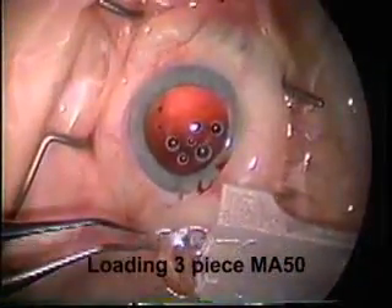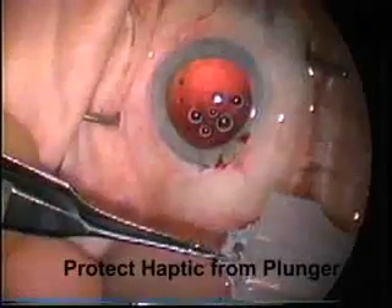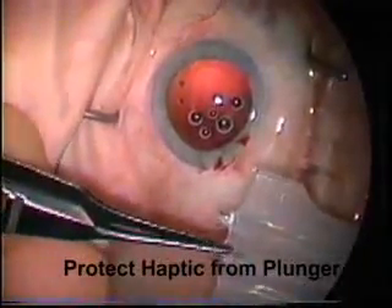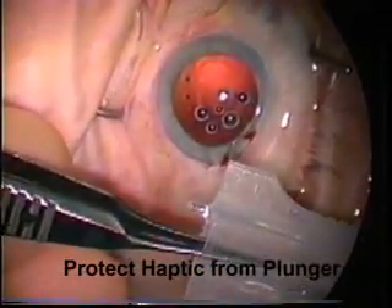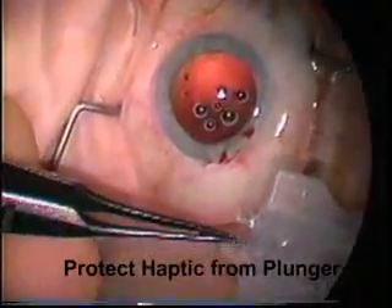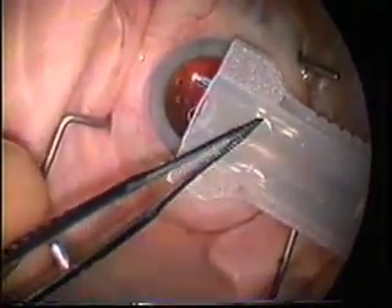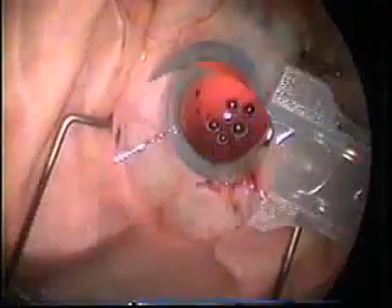The three-piece acrylic lens is loaded in a similar fashion. However, you have to be very careful with three-piece lenses of the haptic, which can be damaged by plungers. The intraocular lens is placed with the optic folded down and the two sides of the optic curling over. The trailing haptic is placed on the side of the knob so the plunger will not damage it. There's the flash of the optic, the leading haptic, and the trailing haptic over the knob.